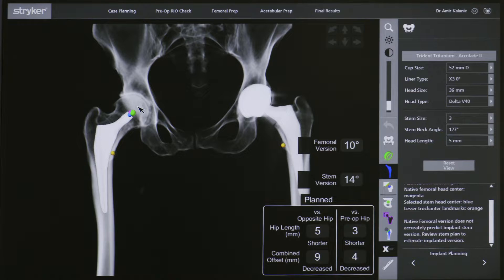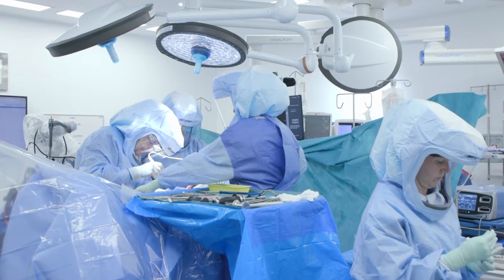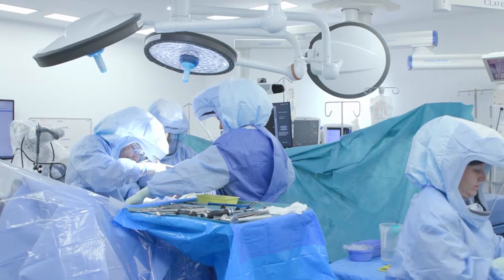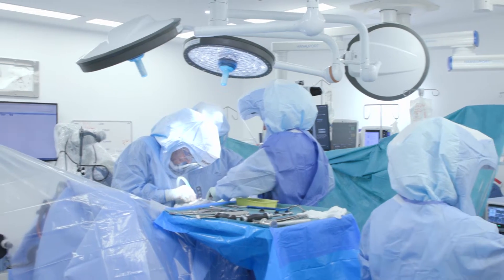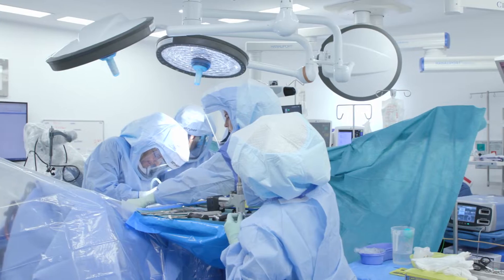Final adjustments and fine tuning are made if necessary, and we then start with the operation. I begin the surgery by making an eight to ten centimeter incision over the anterior and lateral aspect of the hip to access the hip joint. My nursing staff stand on the opposite side of the table, while my orthopedic fellow and I stand on the surgical side.